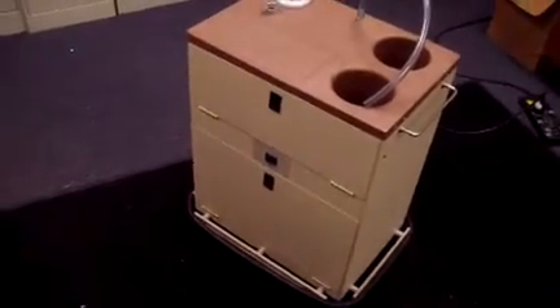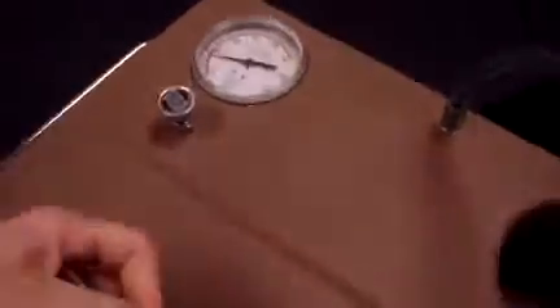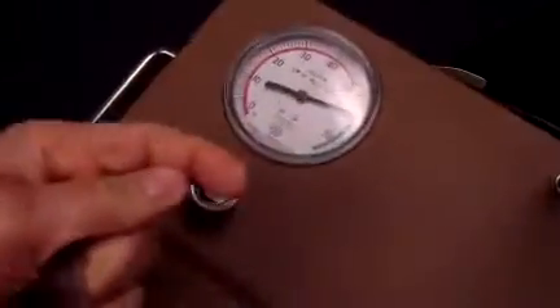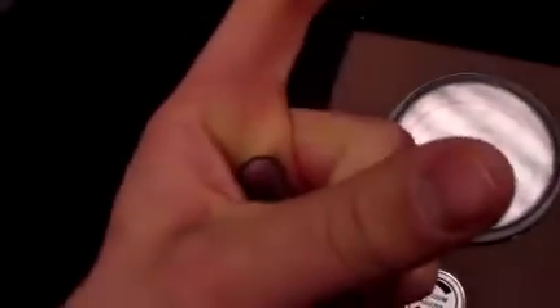This is Keith from DCSP Medical. It's Monday, February 24th, and we are looking at this suction unit. I'll go ahead and power it on. You can hear the motor running, and we'll go ahead and use my hand there. And you can see that it's getting plenty of suction there.